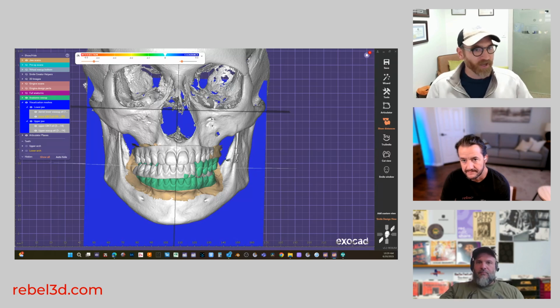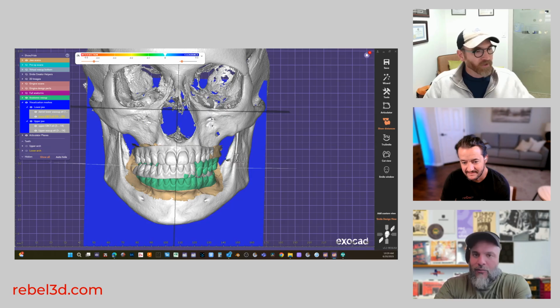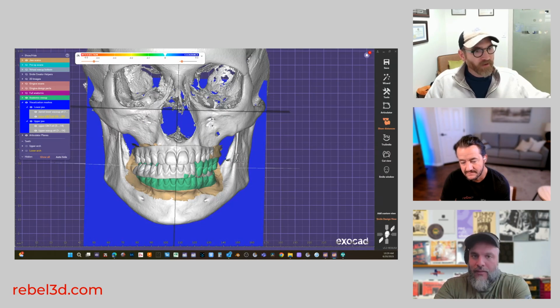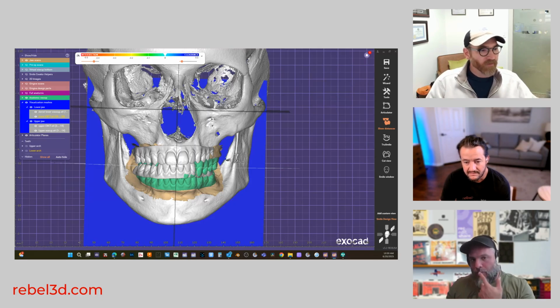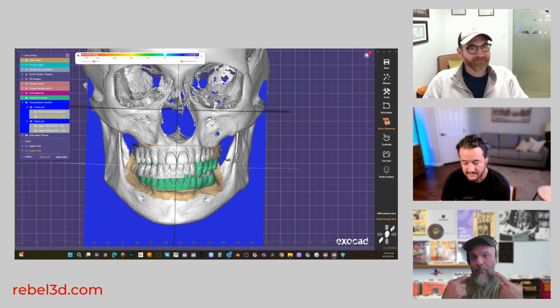I don't know if you feel that way, Daniel, but I actually don't see the use of a face scan, and maybe people are going to lynch me for this, but I don't feel like it adds any information that's better than what I can get from a good 2D image. Yeah. Perhaps the only way that it can help is by showing proper lip support, but it really depends on how well the scanner can actually capture the smile.